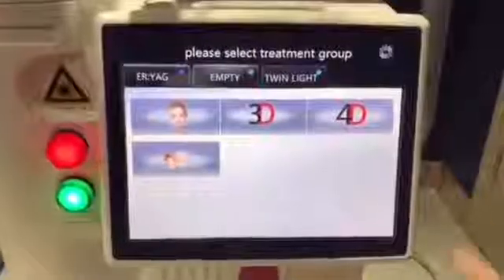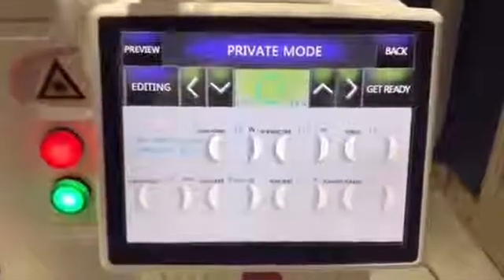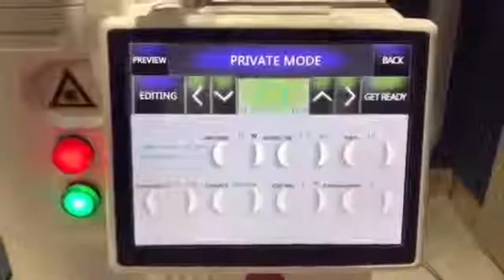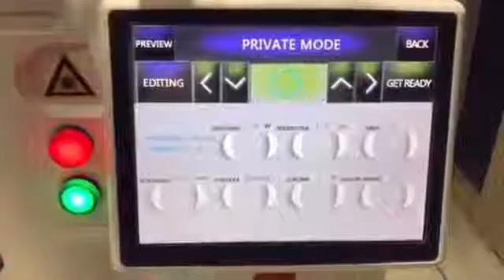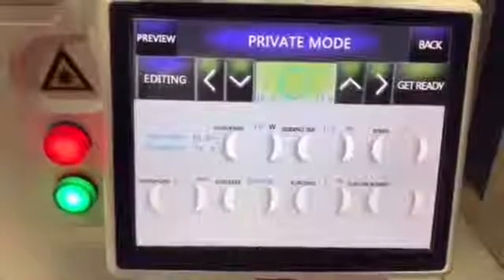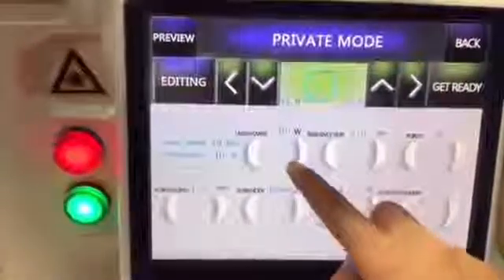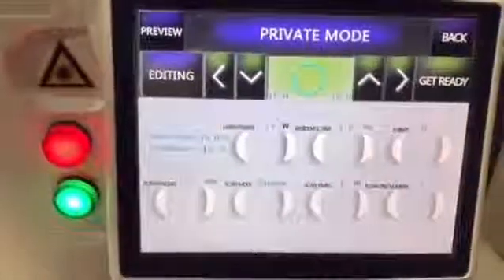Back. For the internal vagina treatment — vagina tightening and rejuvenation — power is adjustable from 1 to 60. We advise a power setting from 15 to 20, starting from 15.